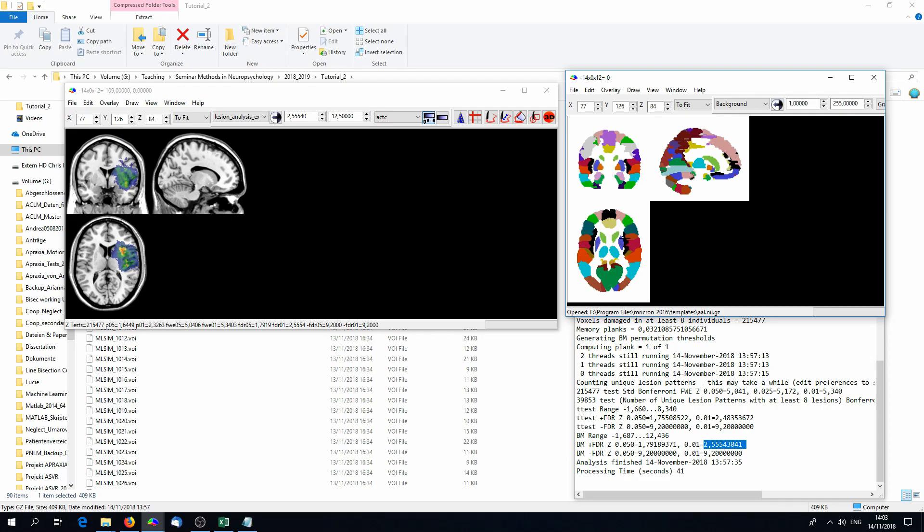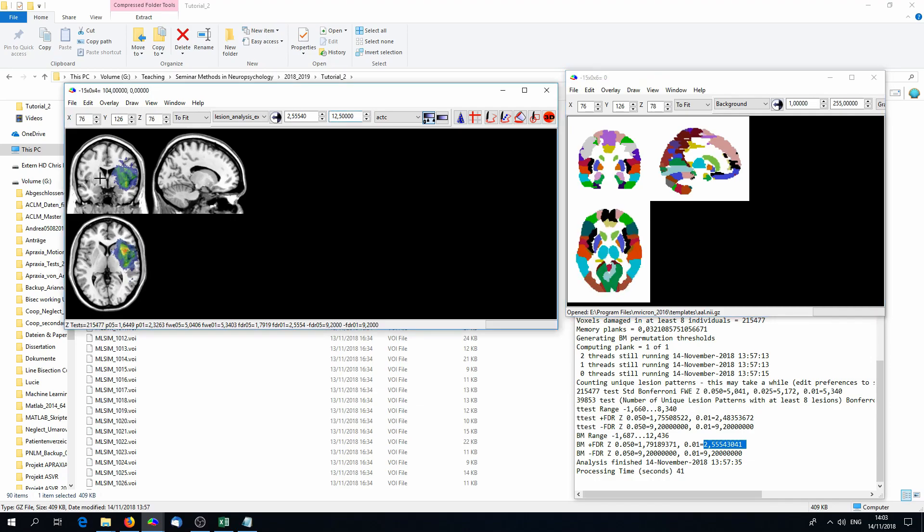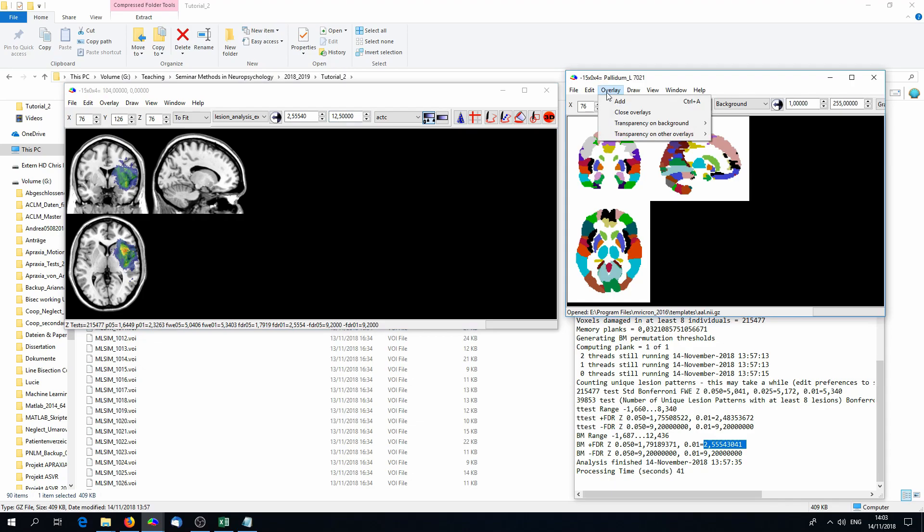The AAL is atlas of cortical regions. You can open it under File, Open Template, AAL, and all patients that had damage to the insula got higher symptoms.